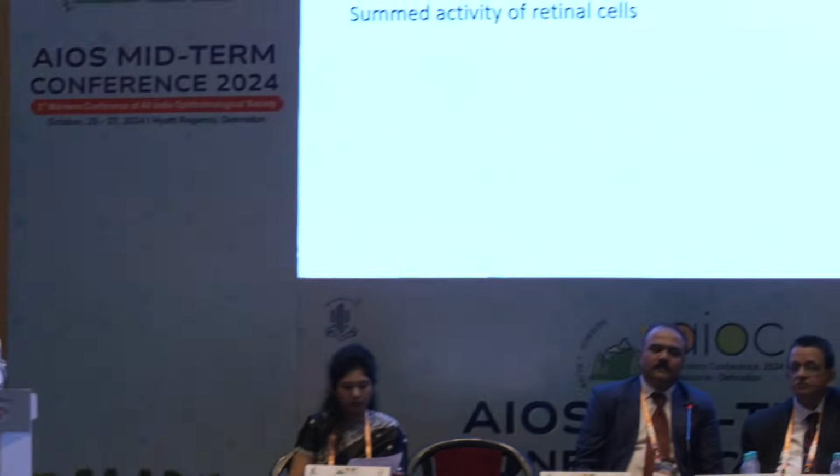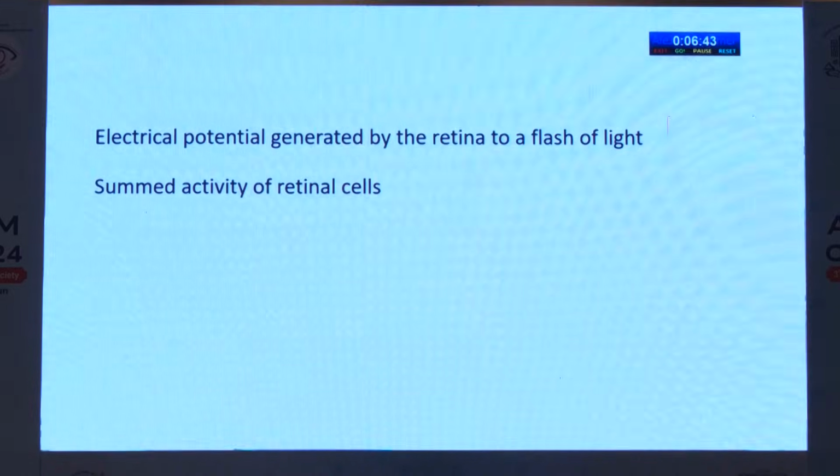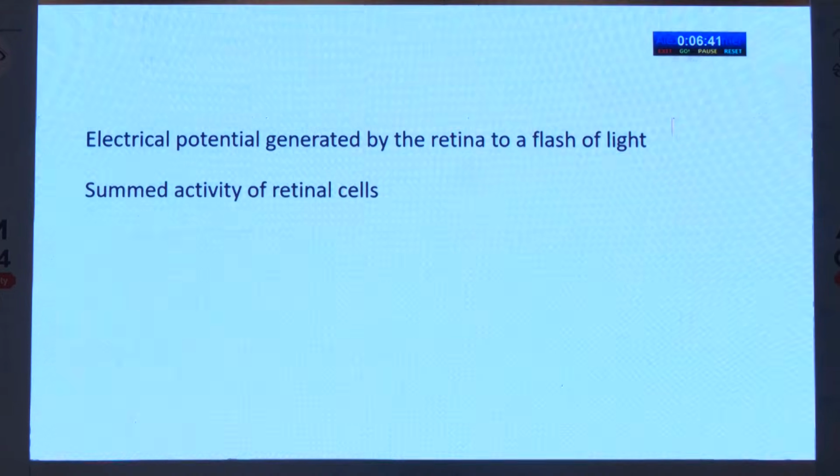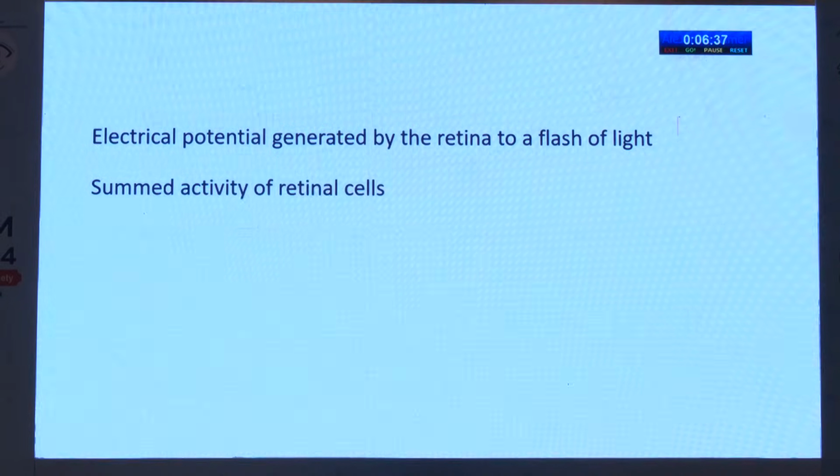Good afternoon all. So my topic is ERG and EOG for general ophthalmologists. The electroretinogram measures the stimulation of the retina when light falls upon it. It is just the sum total of the various electrical activity occurring in the retinal cells.